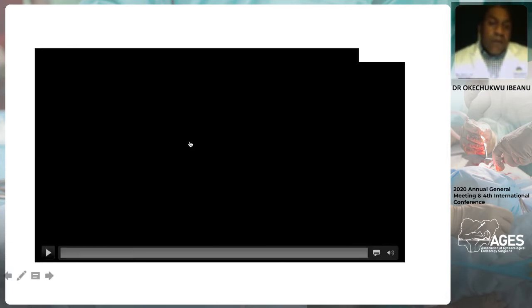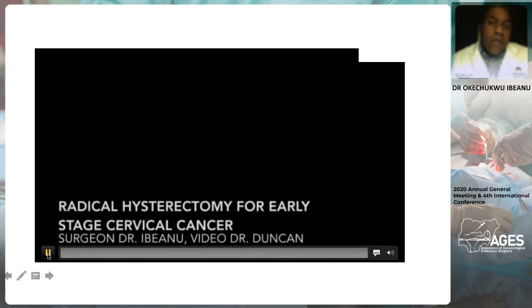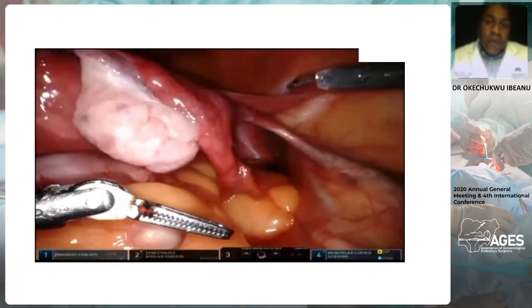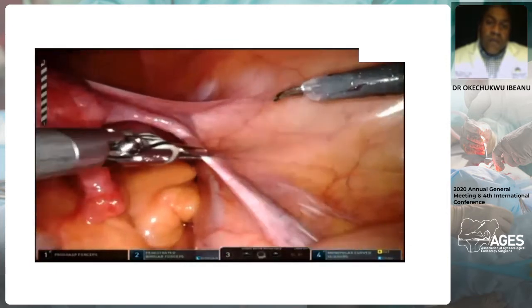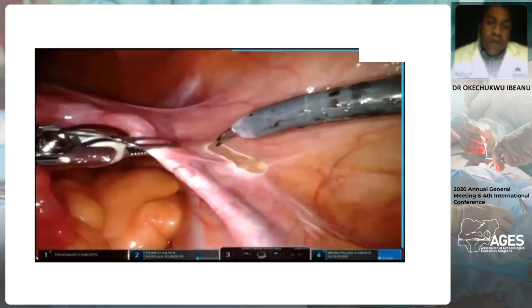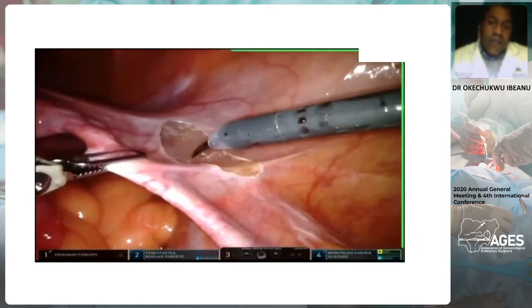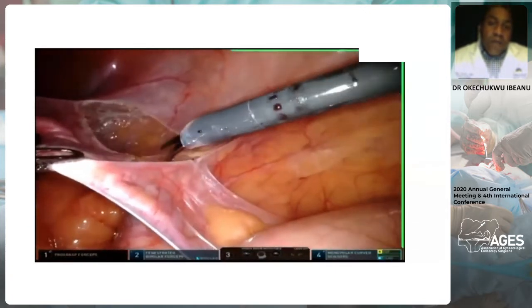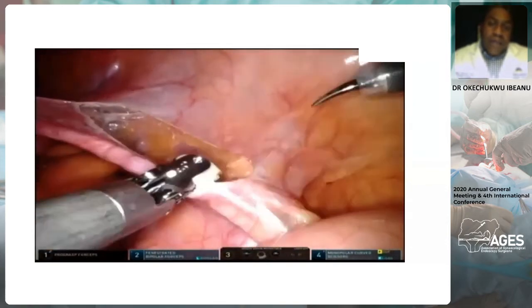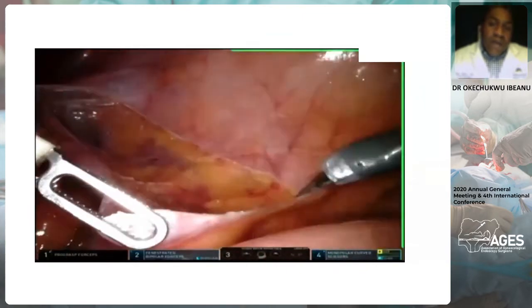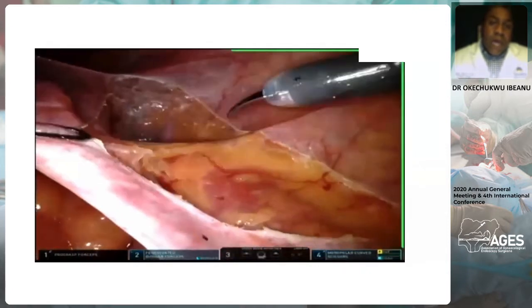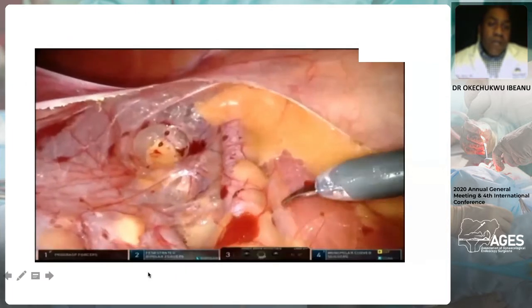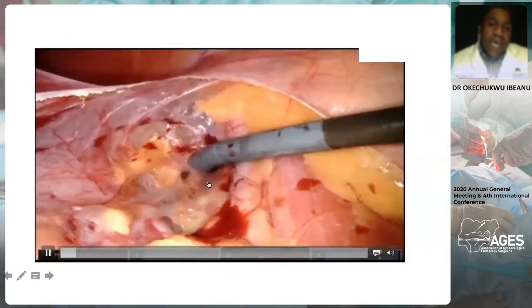We will now review a video of a radical hysterectomy where you will see the development of the retroperitoneal spaces. A retroperitoneal dissection typically begins with a peritoneal incision following the curvature of the pelvis. The incision is usually started over the psoas muscle, not going deeper than the peritoneum, and can be carried as high as needed depending on the surgery. Following that, the subperitoneal tissue is developed by teasing away the fatty adventitial tissue to expose the psoas muscle. The first landmark is the external iliac artery, which forms a triangle with the round ligament and the infundibulopelvic ligament. The ureter is seen on the medial aspect of the peritoneum, and most of the retroperitoneal dissection proceeds in the valley of this triangle.